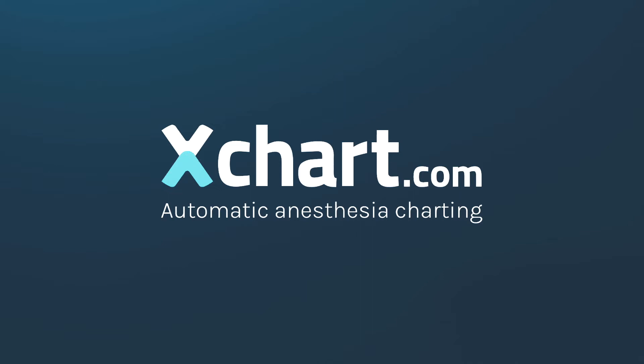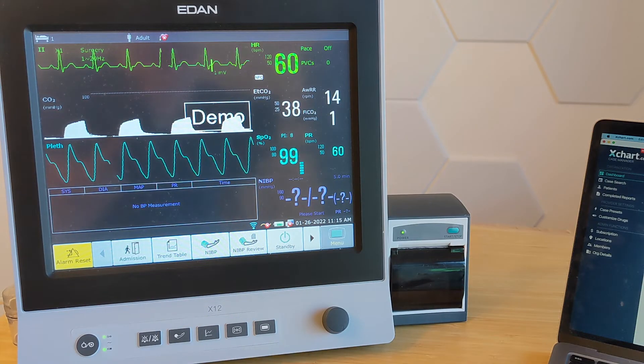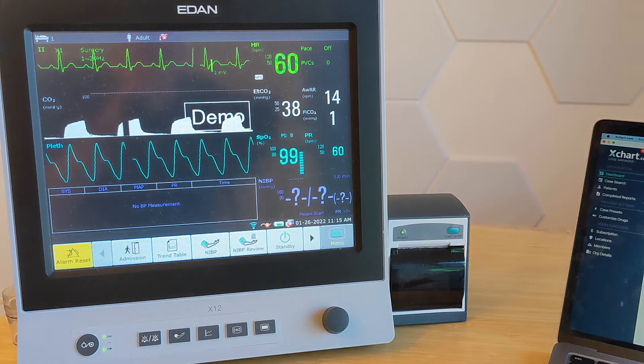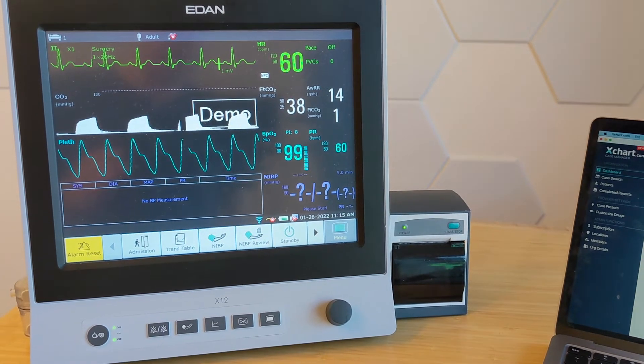Today I'm going to show you how to set up automatic anesthesia charting with xchart.com and the very nice Eden X series monitors.